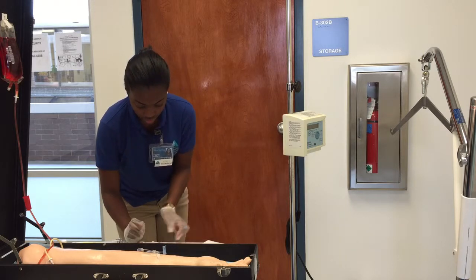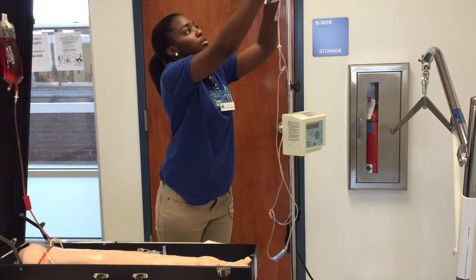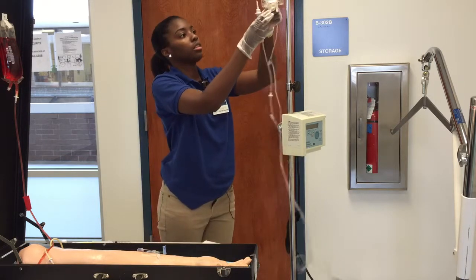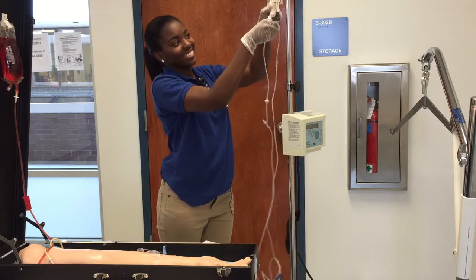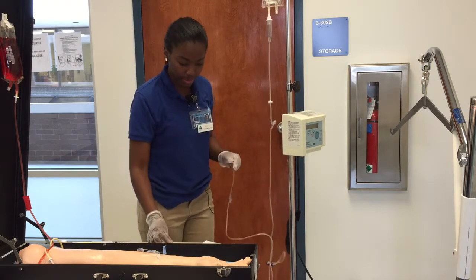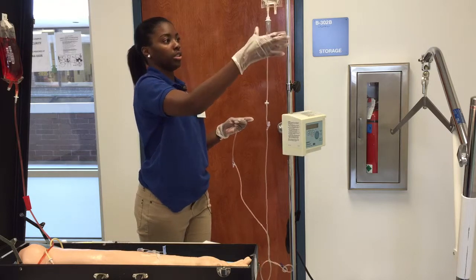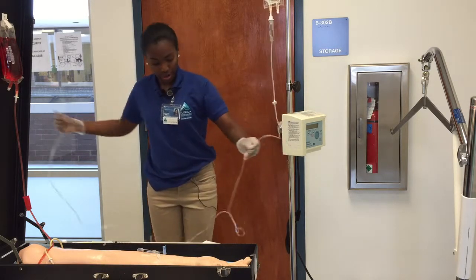Okay. So I'm going to hang my bag. My line is closed. Okay, the line is closed, and I'm going to prime my tube and squeeze the drip chamber. Squeeze, so halfway full, and then I am going to prime my tubing.